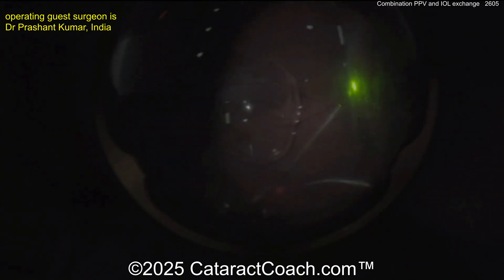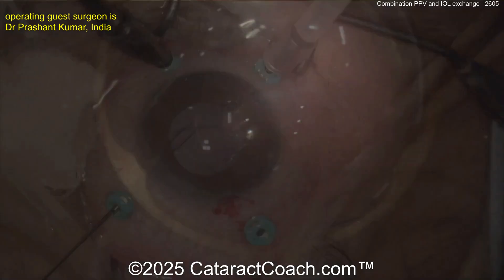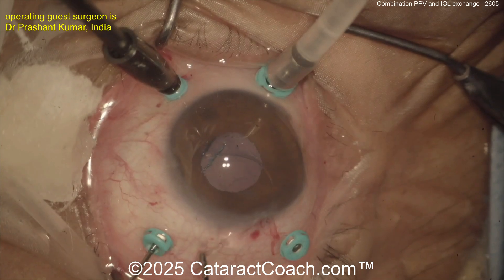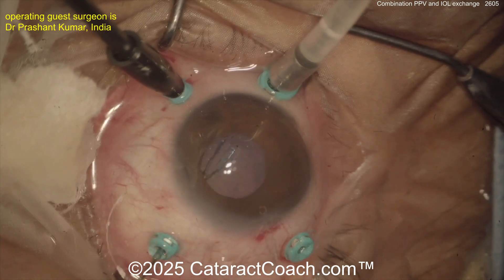Tell me about the laser going on right here. I don't routinely do a 360 prophylactic laser — I know some surgeons do, and it may decrease the risk for retinal detachment. But I think if you just do a thorough vitreous shave and look for any peripheral pathology, certainly do a targeted laser. It makes a lot of sense.